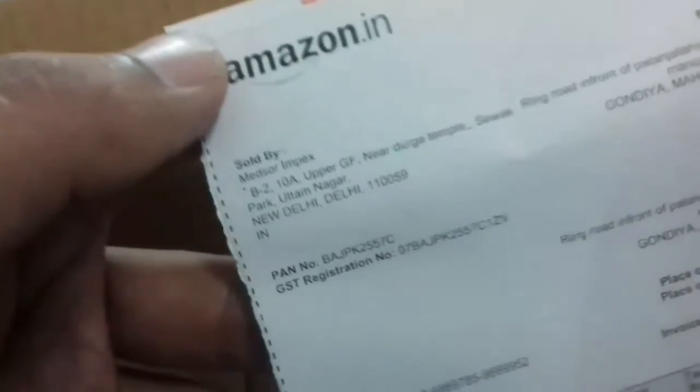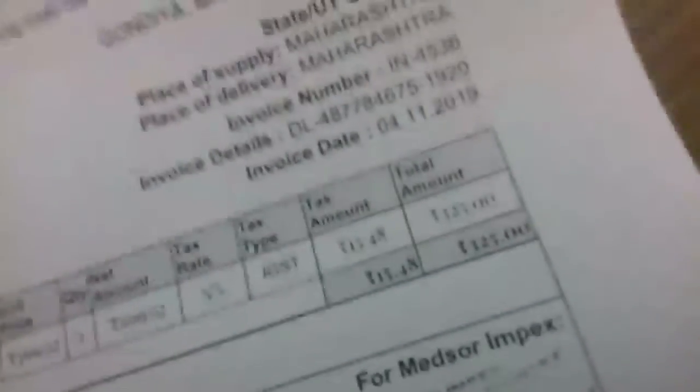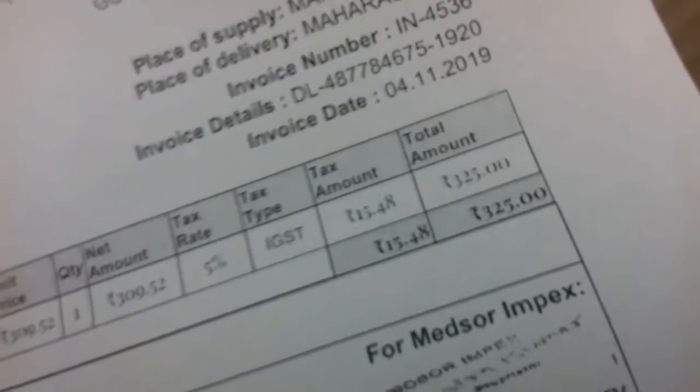This is the bill — dispatched from New Delhi. Look at the price: 325 rupees. The rest of the box is empty, so now I will show you the instrument.